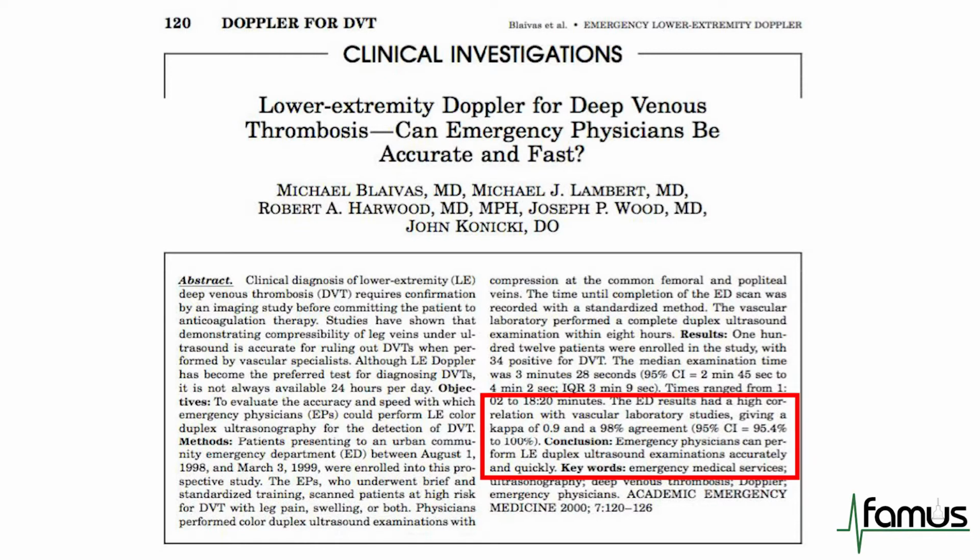The summary statement was that the kappa was 0.9 and there was a 98% agreement between emergency physicians and the vascular laboratory. And this was the first of a number of papers which showed that emergency department clinicians can quickly and confidently learn these skills.